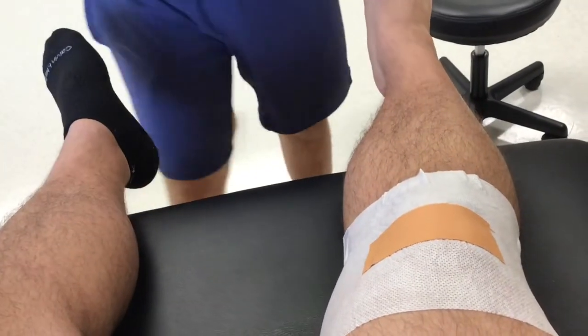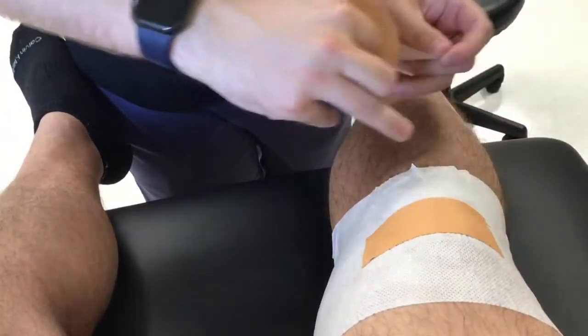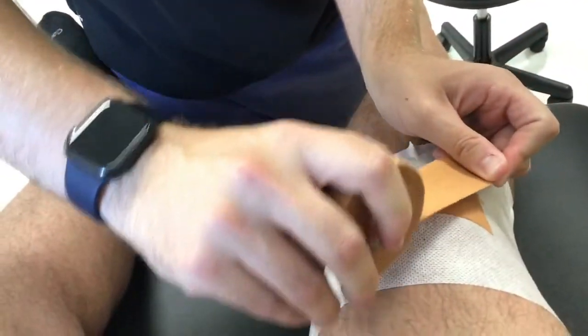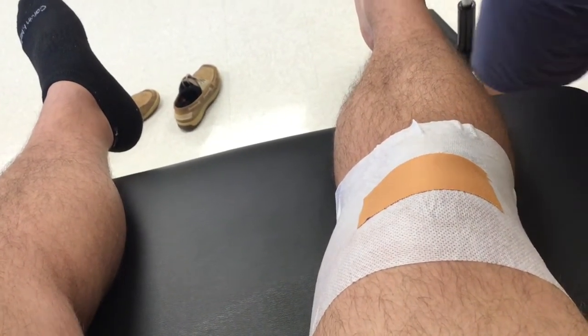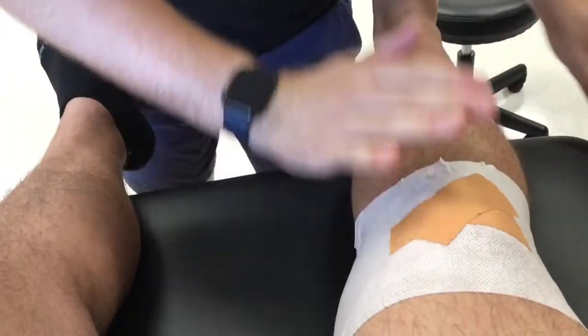The second strip is going to be a little bit lower and it's going to be angled towards the opposite shoulder. So the low bottom part laterally of the knee, and then we're going to pull him up to his shoulder. This is a tilt correction. So pull him up there.